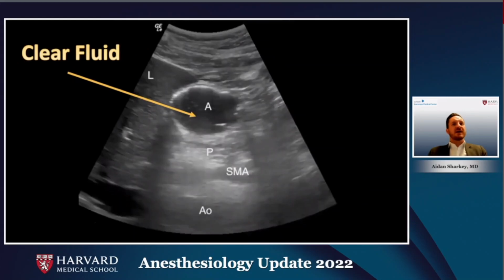Gastric secretions and clear fluids, such as water or black tea, appear hypoechoic in appearance. When containing fluid, the antrum begins to distend and become thin-walled, unlike the thicker-walled appearance in an empty state. The hypoechoic muscularis layer also becomes thinner as the antrum distends.